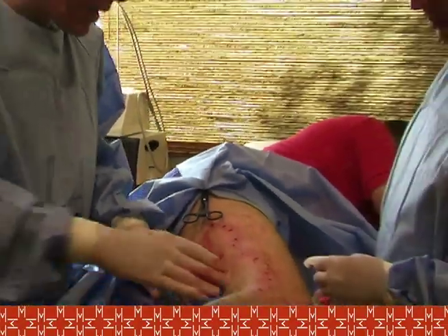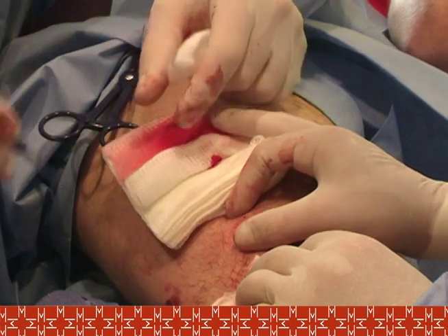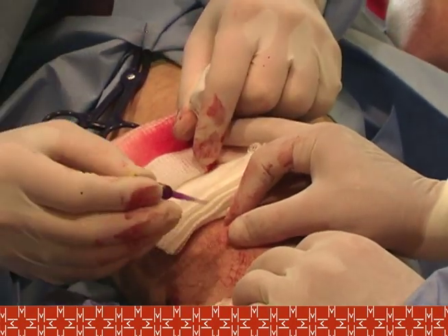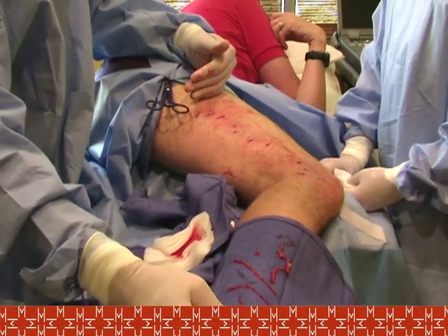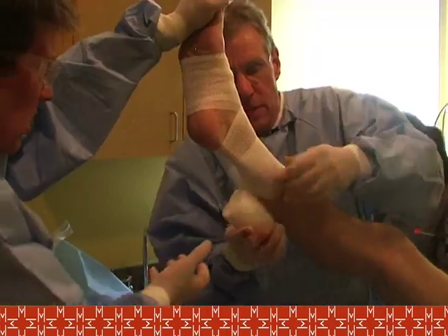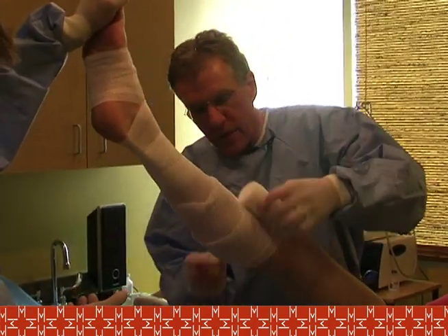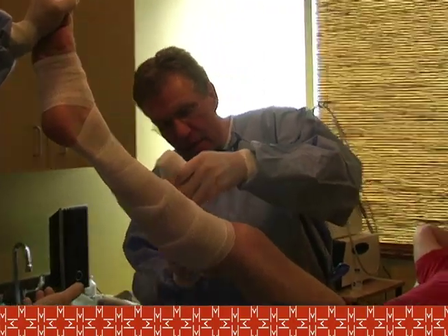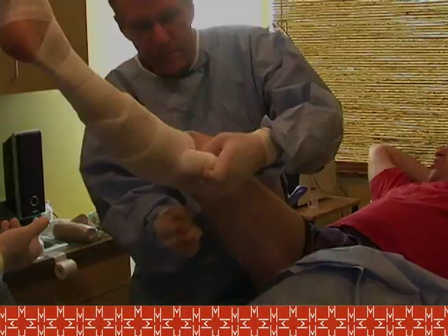Our next step is to clean the leg off, and we close each of these incisions with a special glue — Dermabond glue — that will simply seal up the locations. We're going to apply a pressure dressing, wrapping the leg in its entirety for about a day and a half to two days. We'll remove the dressing thereafter. We're putting on a layer of Curlex, and as I approach the operative area I'll apply a so-called ABD pad — a compression pad — over the phlebectomy sites.